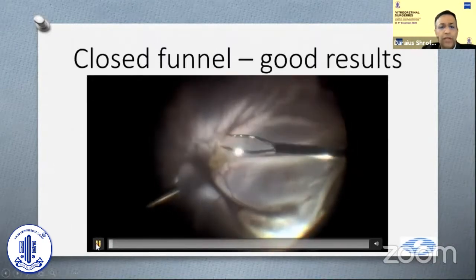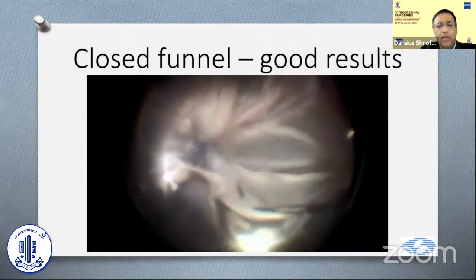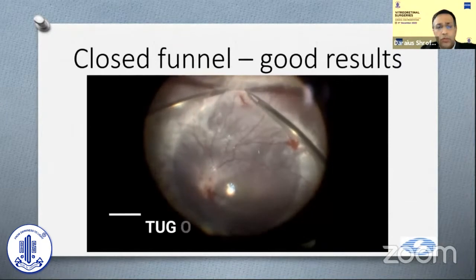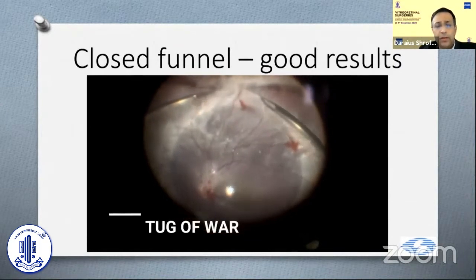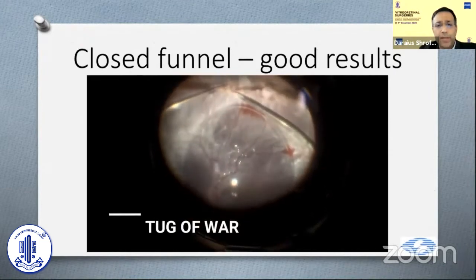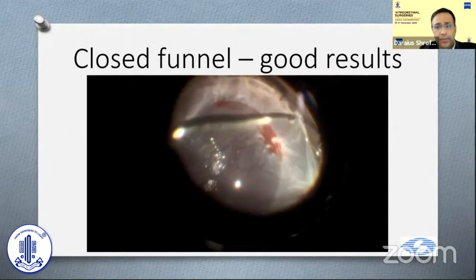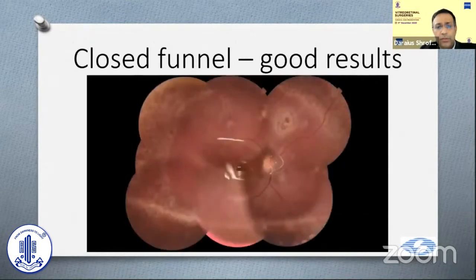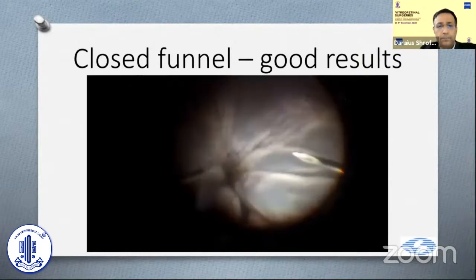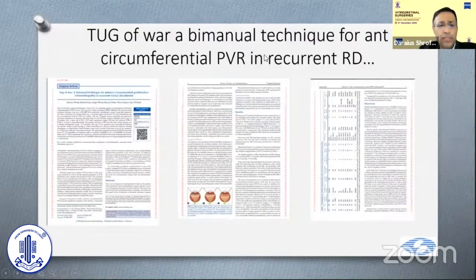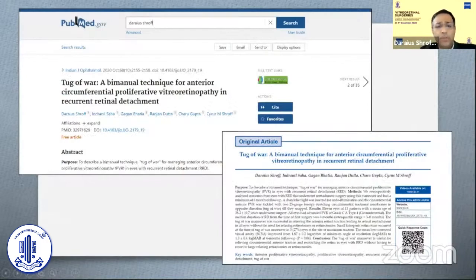This maneuver gives good results even in severe cases with close-funnel detachment, and very often we see such cases post-buckle. You can see the two forceps performing the tug of war. Basically it prevents us from having to do large or relaxing retinotomies in the periphery. This young girl had nicely attached retina post-operatively as shown in the post-op photograph. This technique is published in a recent issue of the Indian Journal of Ophthalmology — 'Tug of war bimanual technique for anterior circumferential PVR and recurrent RD.'